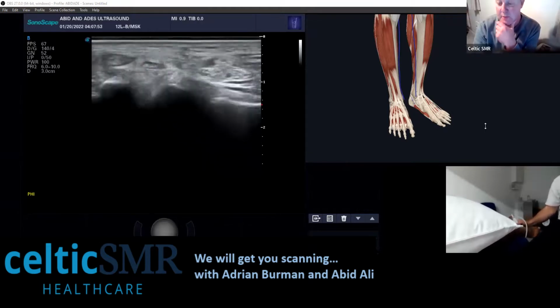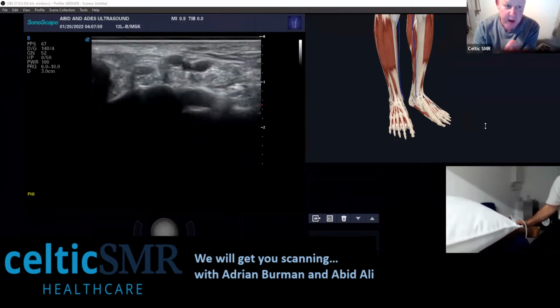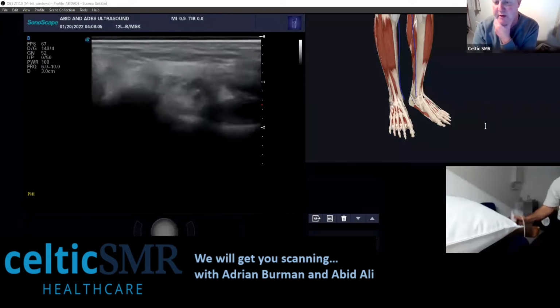Okay, thank you. Another question coming from Olga, which crossed my mind when you were talking about neuromas there, and you put the gain up. Are there any other pathologies that you would use that kind of technique or trick, for want of a better phrase?